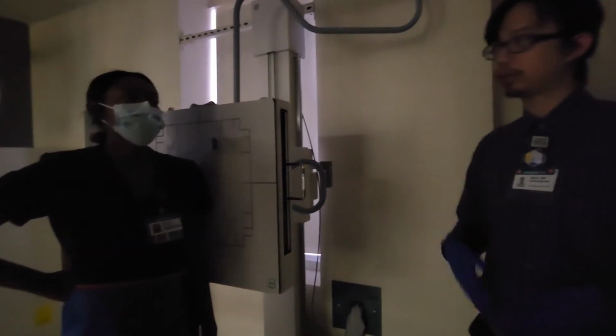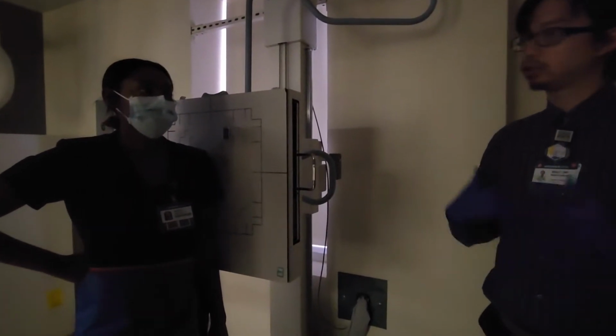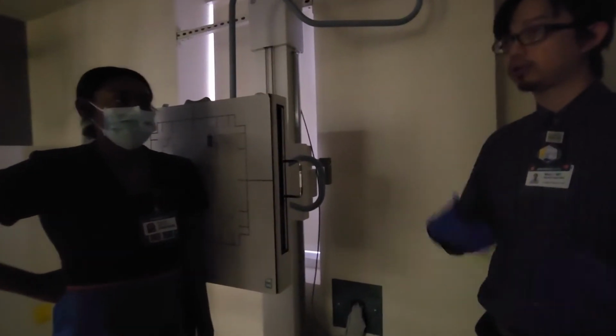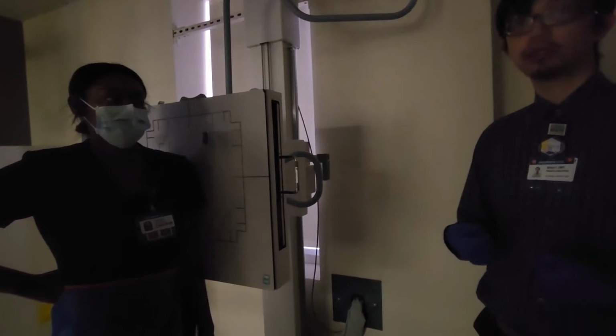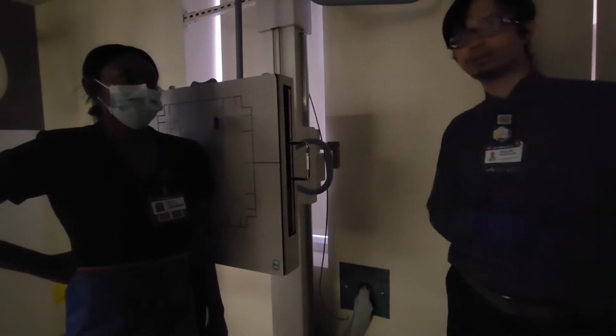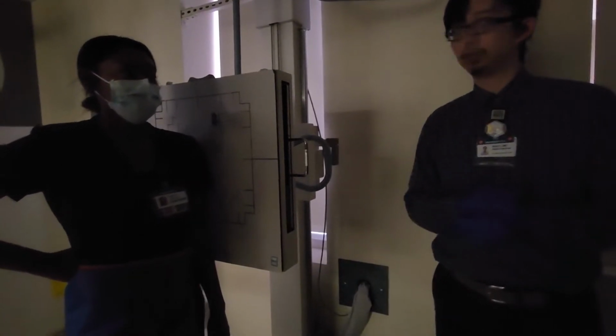So during this time, the patient's going to be breathing, right? So the lungs are moving, the heart is moving, and when they breathe, and you're doing this long x-ray, it's going to create motion in the image. Normally, motion is bad because we want to see anatomy holding still.